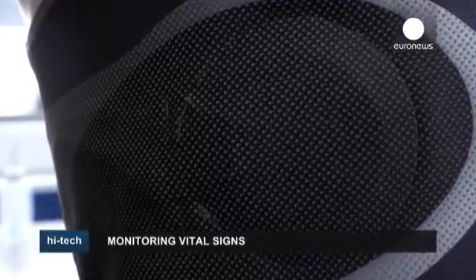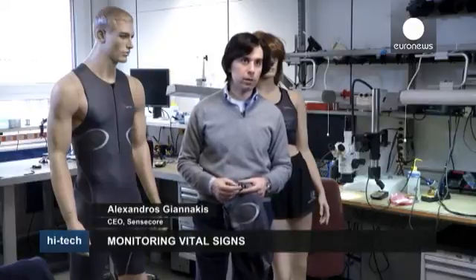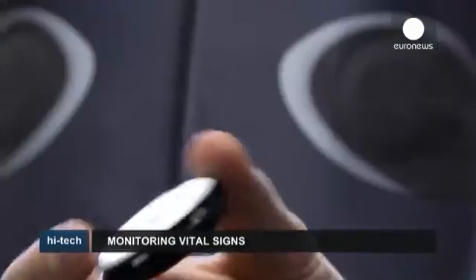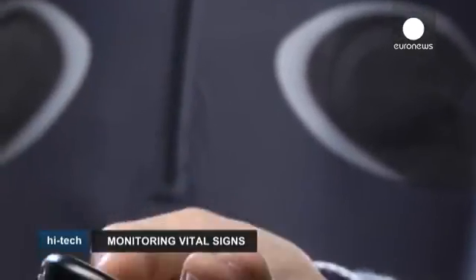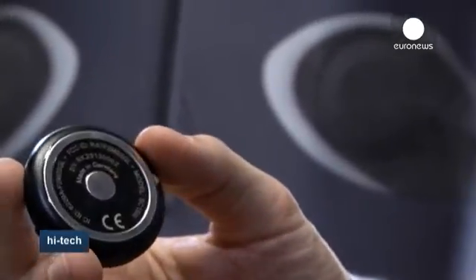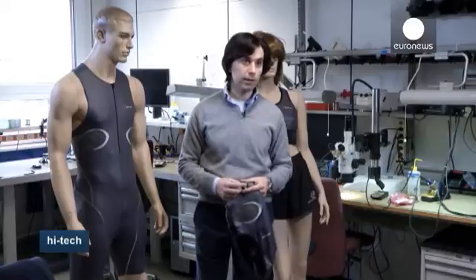One of the biggest challenges in professional sports is recovery monitoring. In order to assess recovery, the best way to do that is by monitoring the sleep of an athlete. Using these technologies, you can see how many times the athlete moves during the night, the minimum values of heart rate, breathing rate or body temperature. It's basically all the information you could get in a sleep clinic.